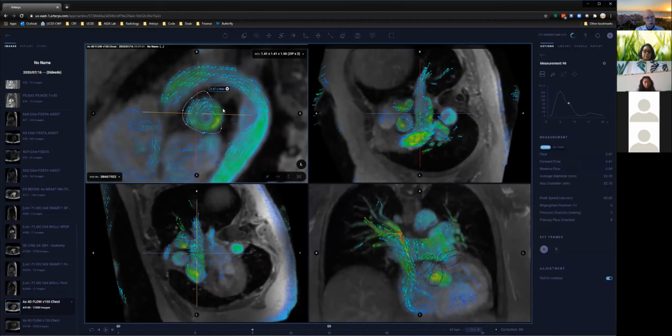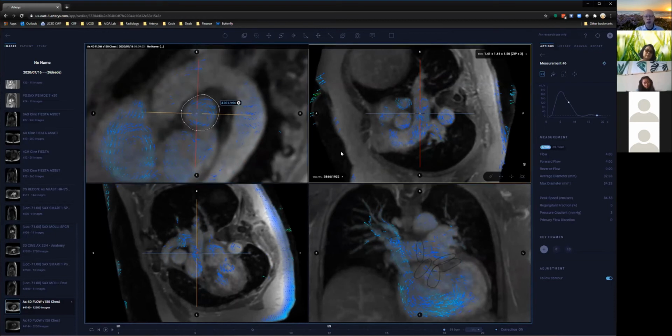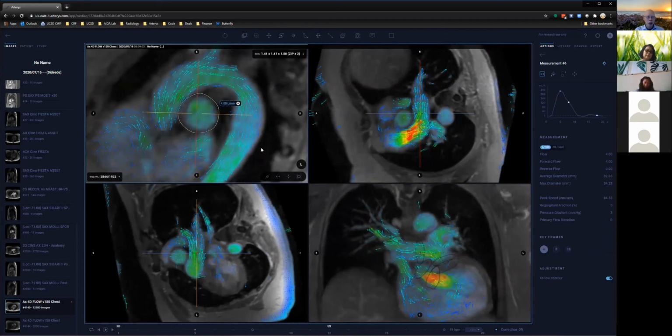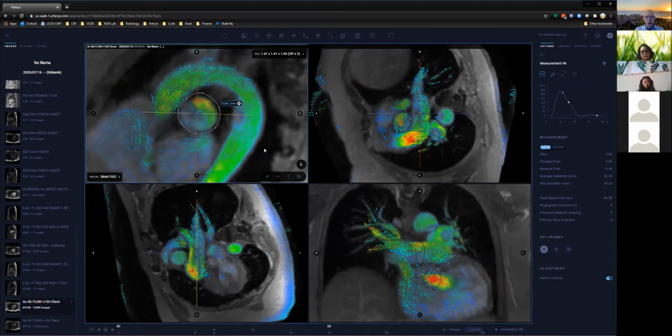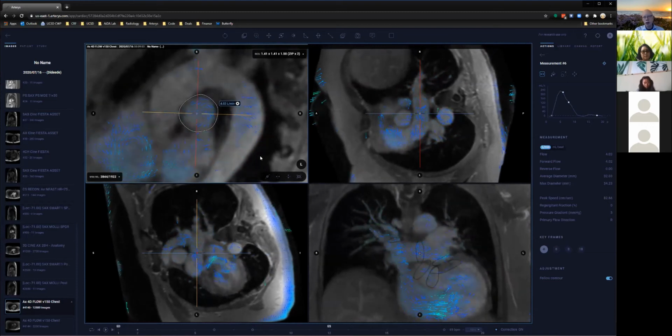In certain patients, it's definitely seen in TET and other things, asymmetric blood flow. And one of the papers that I never got around to resubmitting was a comparison of branch pulmonary artery flow measurements, the fraction that goes to the right lung and the fraction that goes to the left lung, and how they correlate with nuclear scintigraphy, quantitative flow measurements, or perfusion from nuclear scintigraphy.